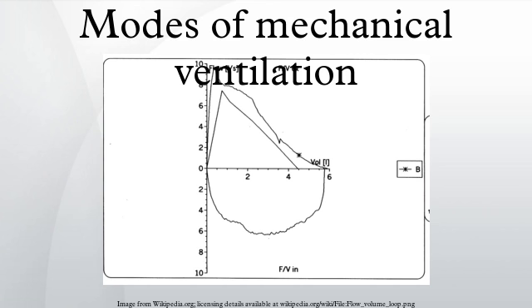Continuous positive airway pressure. Continuous positive airway pressure is a non-invasive positive pressure mode of ventilation. CPAP is a pressure applied at the end of exhalation to keep the alveoli open and not fully deflate. This mechanism for maintaining inflated alveoli helps increase partial pressure of oxygen in arterial blood. An appropriate increase in CPAP increases the PaO2.